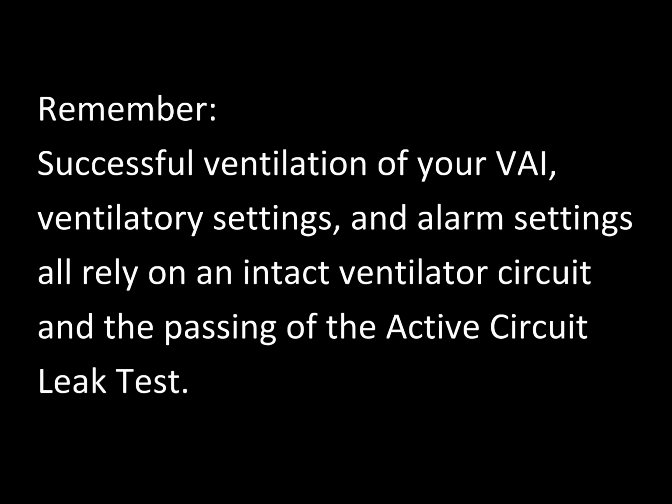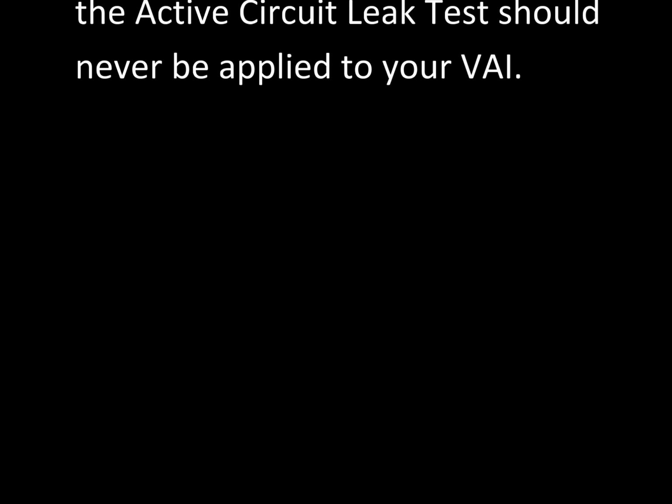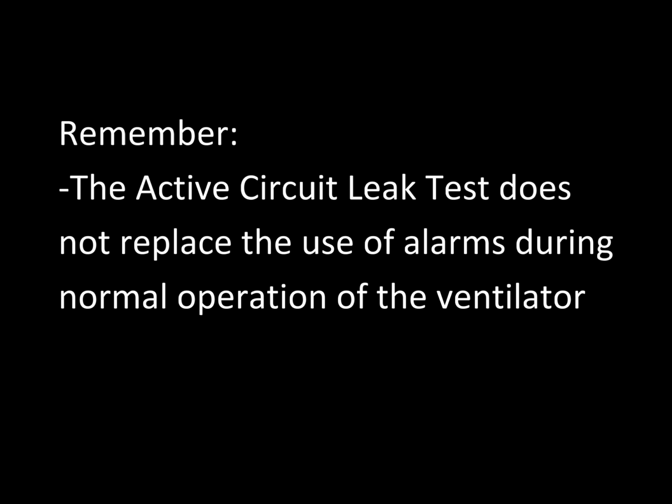Remember, successful ventilation of your ventilator-assisted individual, ventilatory settings, and alarm settings all rely on an intact ventilator circuit and the passing of the active circuit leak test. An active circuit that does not pass the active circuit leak test should never be applied to your ventilator-assisted individual. Remember, the active circuit leak test does not replace the use of alarms during normal operation of the ventilator.